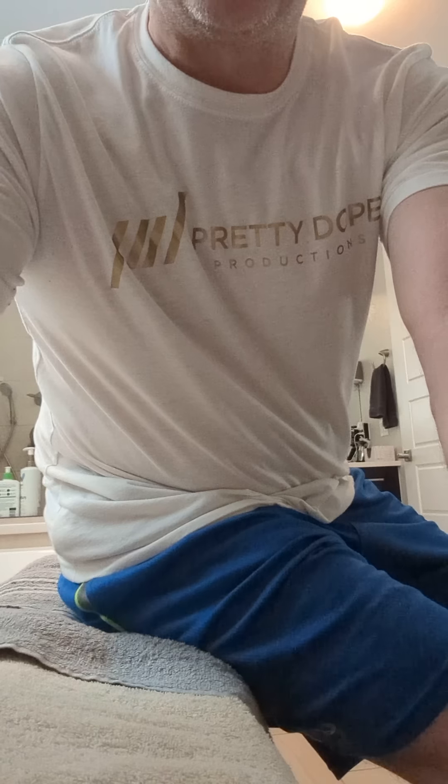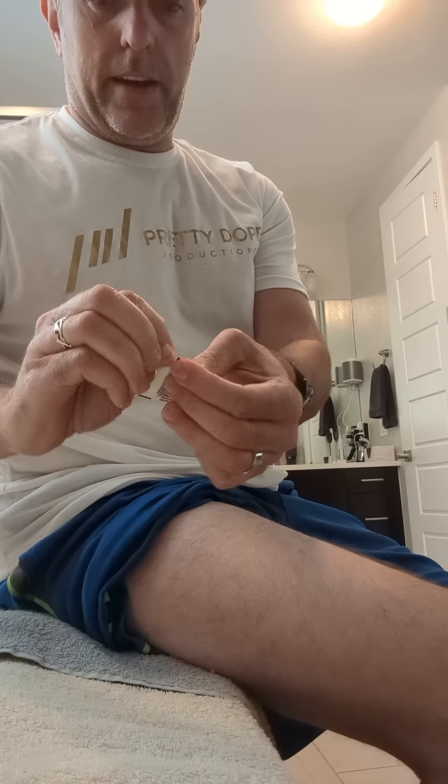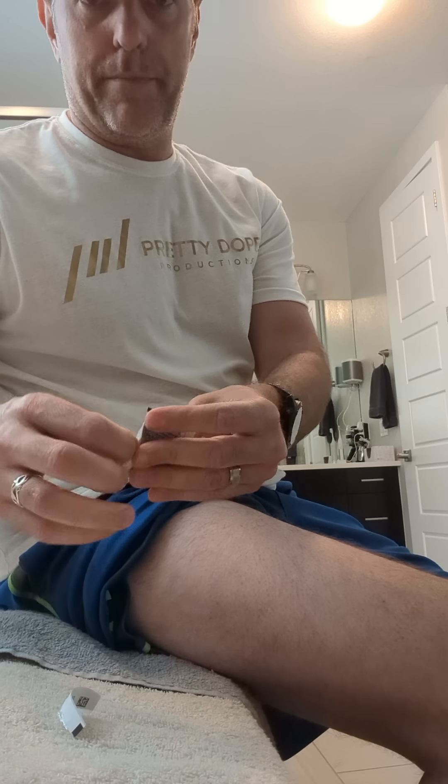I'm going to show you just how I do it. You're supposed to do it in your leg or your belly. I've never done it in my belly because that's a little intimidating for me, so I just do it in my leg, and I usually just take an alcohol wipe and clean it off for a little bit.